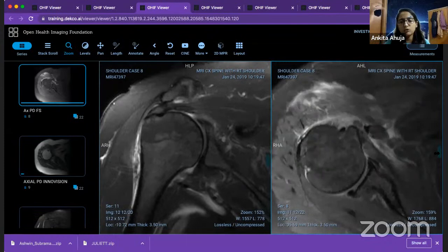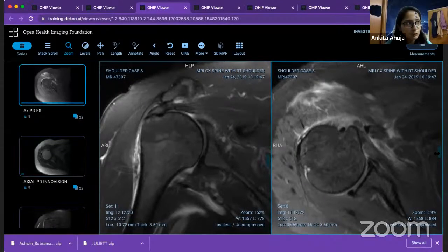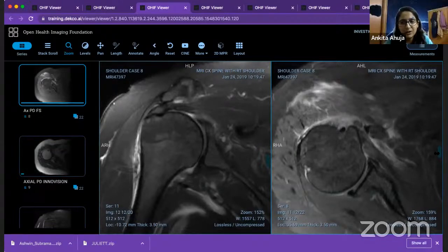What else do you think when you see a lot of edema? We had discussed it. If not me, anybody else would have definitely discussed it. I'll tell you two common things. Somebody was trying to say something. Muscle sprain or internal degloving. But I say there is not a significant trauma. So in fact, you would be telling me, no, I don't think it's a significant trauma to have that kind of a picture. So you would be helping me to rule it out in real life.